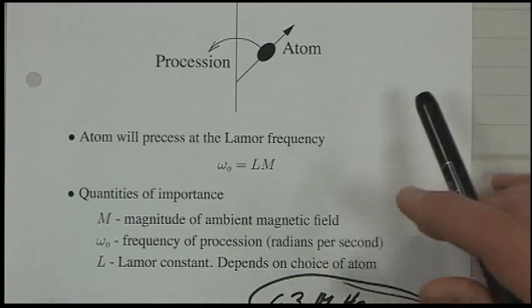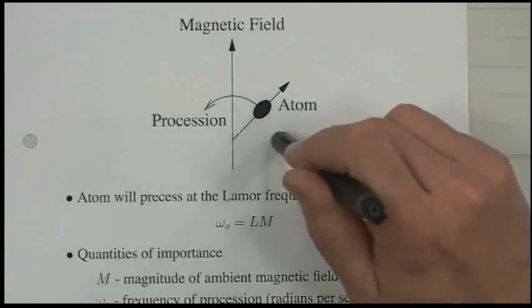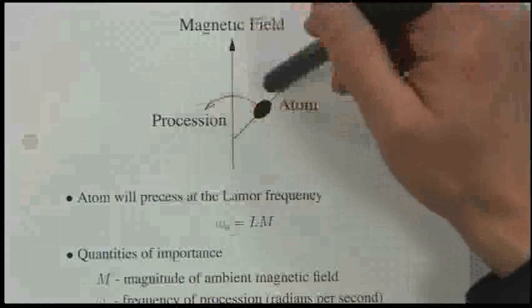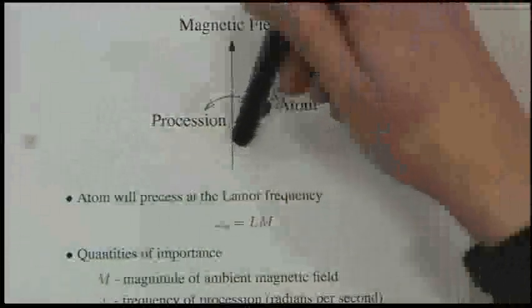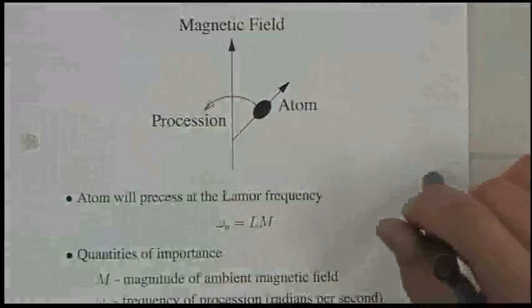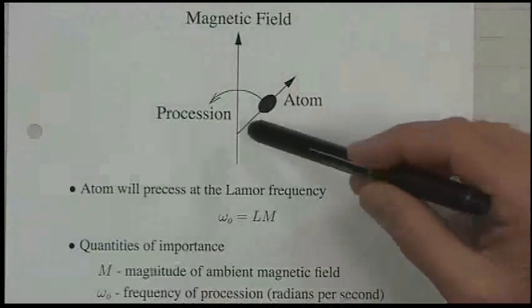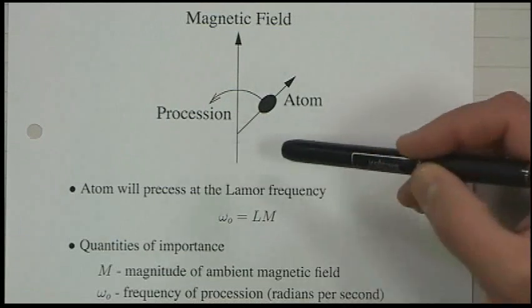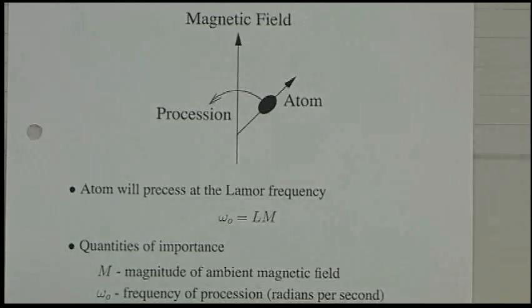So what ends up happening is that you can transmit an RF signal at 63 megahertz into the material, and that RF signal will cause these atoms to precess. You'll basically pump energy into it, and they'll precess, okay? And the way they describe that is the tip angle increases. This gets into more physics than I want to deal with here. But then if you remove the excitation in the form of the RF signal, they'll actually re-radiate energy out. So they'll transmit at that same center frequency. Okay? So that's the underlying phenomenon we're going to use to do this.